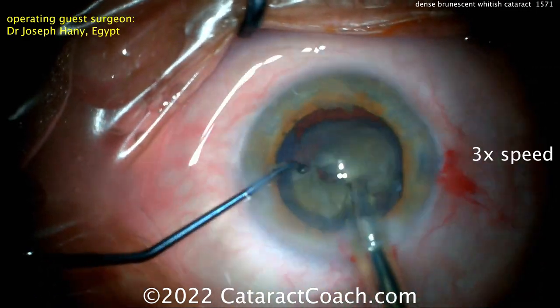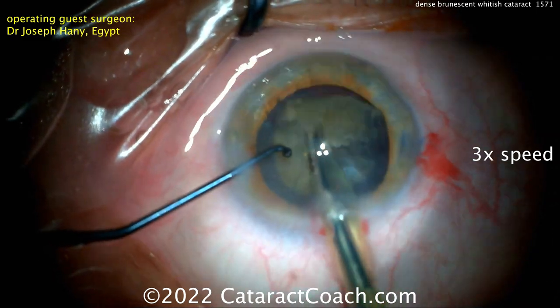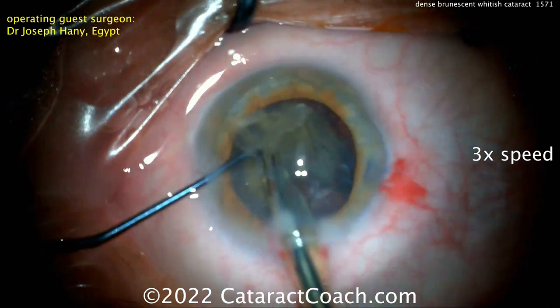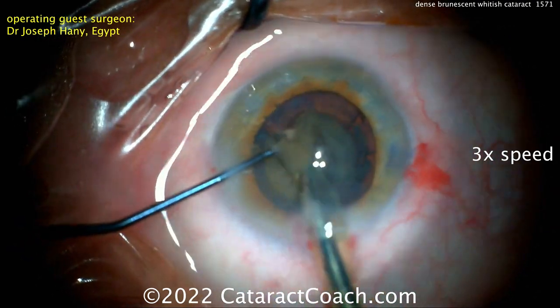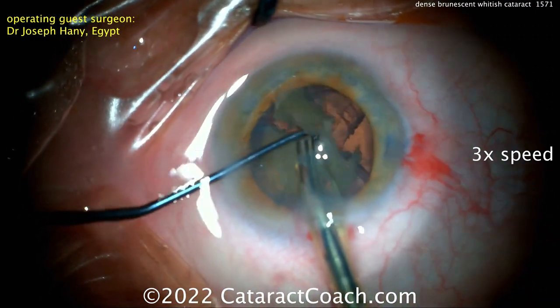You may need to use increased phaco energy in a case like this, so keep an eye on that. Another nice chop there. If you start to creep up and have too much phaco energy, it's okay to come out of the eye and recoat the endothelium with more dispersive viscoelastic to protect it a little bit more — also depending on how much fluid you run through the eye. This is a really nice technique.